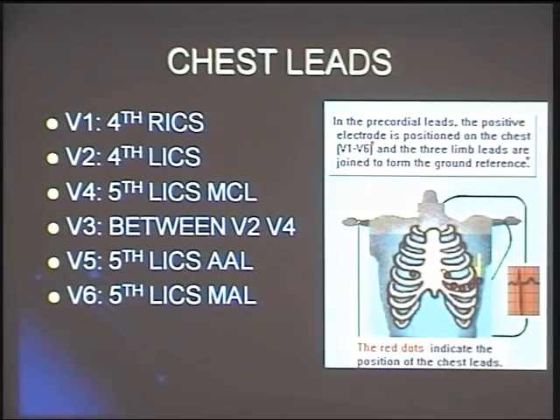So now I have developed 6 limb leads. Is that clear? 3 bipolar leads, 3 unipolar leads, how to augment the 3 unipolar leads, and what surface I am looking at through this limb. The only one thing about lead AVR, the lead AVR is here, isn't it? Lead AVR is here looking at my right superior surface. My sinus node is here, my sinus node impulse is coming down, my ventricular depolarization is going towards my left ventricle. So my sinus node is depolarizing the atrium which is coming down. So it is going away or towards lead AVR? Away. So what will be my P wave in AVR?